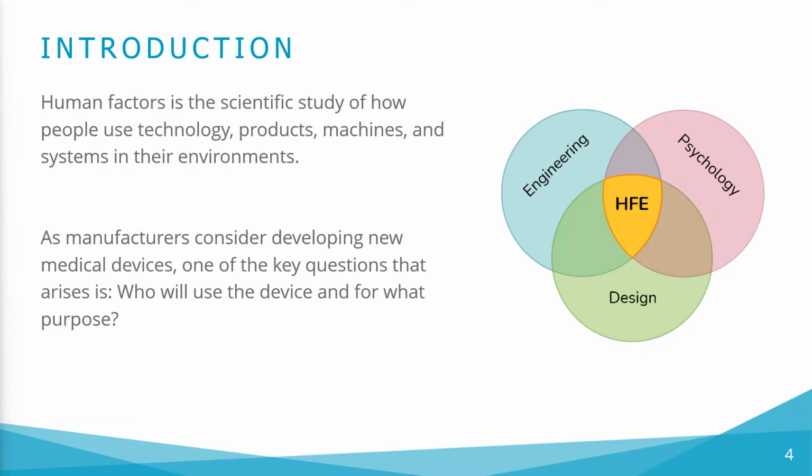As manufacturers consider developing new medical devices, one of the key questions that arises is: who will use the device and for what purpose? To understand the application of usability engineering to medical devices in detail, IEC 62366-1 is available. Now that you know the definition, let us first look at the need for human factors.